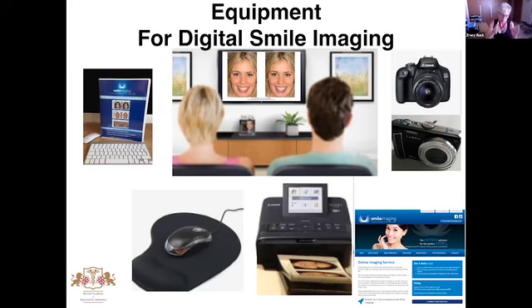But when the patient is either with you virtually online or when you're talking to the patient in the practice, if you've got the image on your computer screen, or if you've got a big TV screen like this, then that's really powerful for them to see, and buy the emotion when they see the pictures blown up like that. And as we mentioned, a mouse is actually the best thing for imaging. Sometimes dentists ask whether they can just use a finger pad on a laptop, but it does make it more difficult. So if you can dig out an old-fashioned mouse from the back of a drawer, that will work perfectly for you.